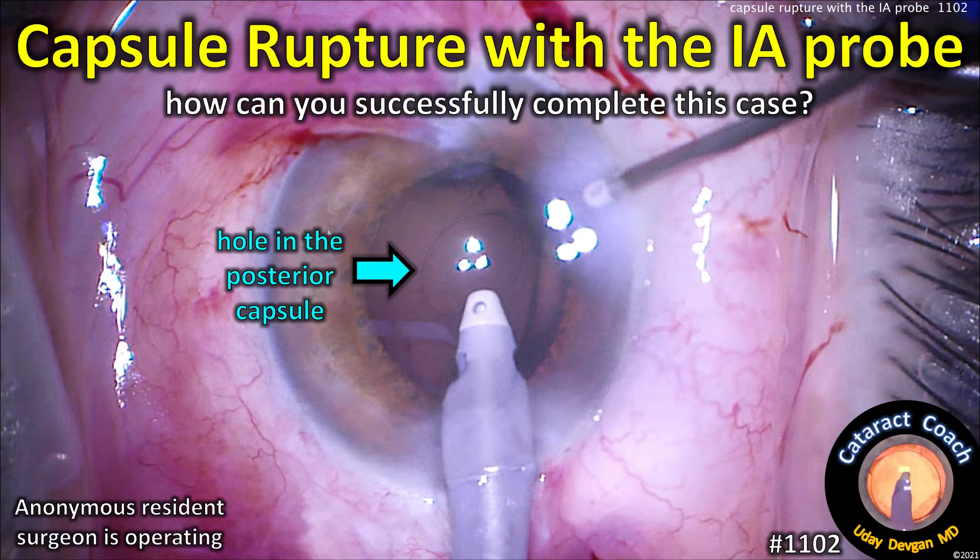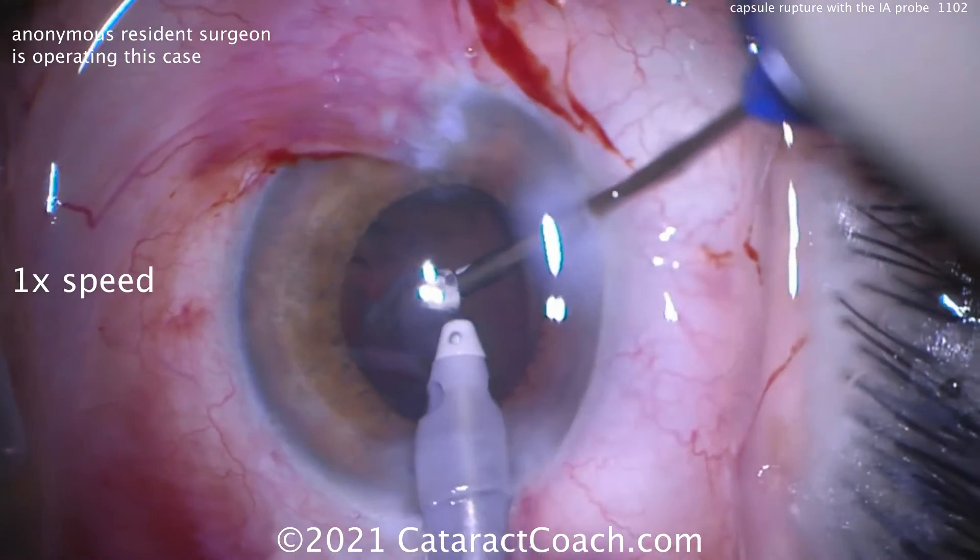CataractCoach.com. Capsule rupture with the IA probe — how can you successfully complete this case? An anonymous resident surgeon is operating, so let's learn.